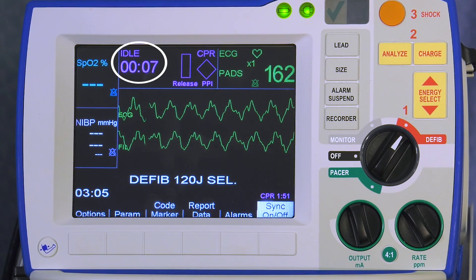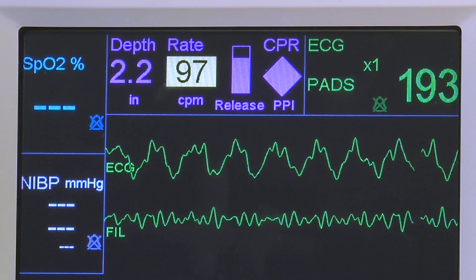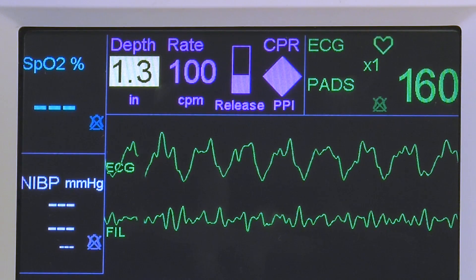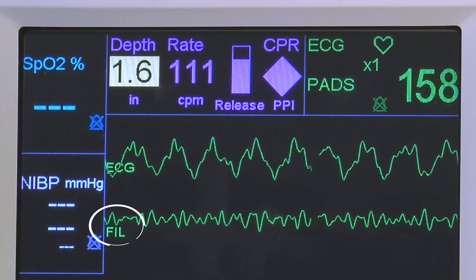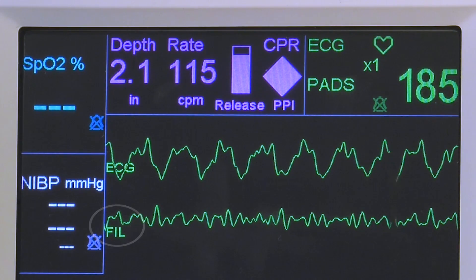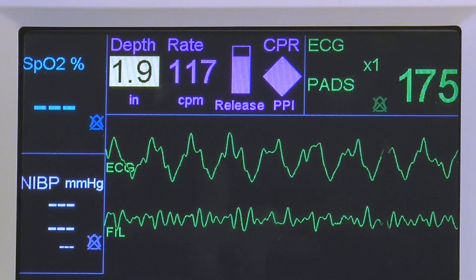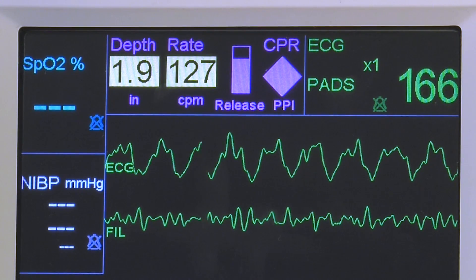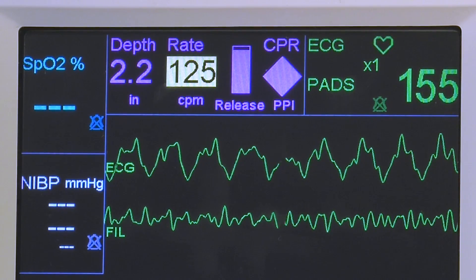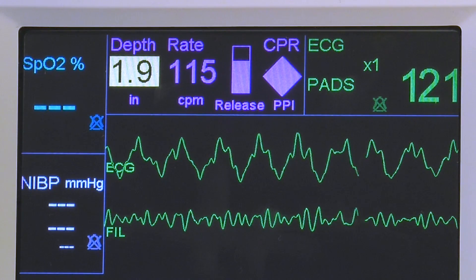The see-through CPR feature of the R series filters compression artifact from the ECG waveform, resulting in a filtered ECG waveform labeled as FIL. This allows you to view underlying rhythms without the need to interrupt compressions. However, it is not intended to replace assessment and does not work in pacing mode. CPR compressions should be paused when assessing ECG for a shock or no-shock decision.